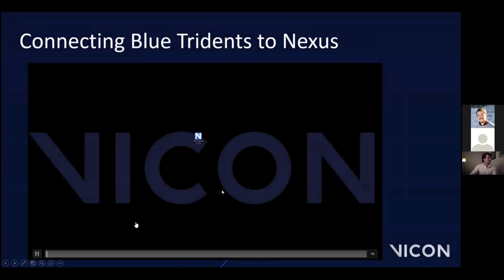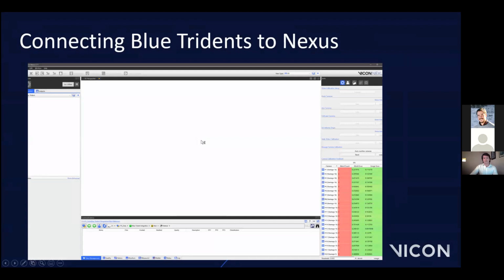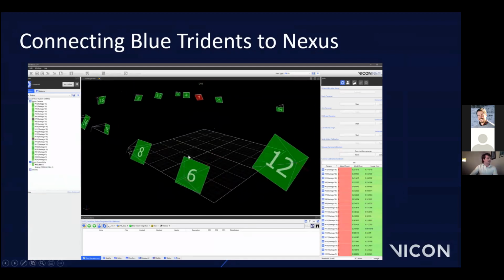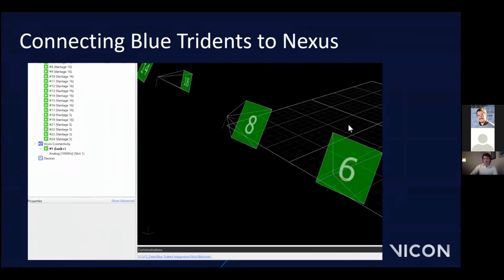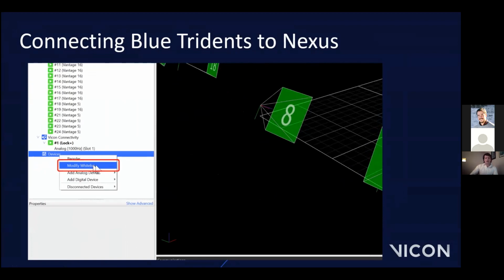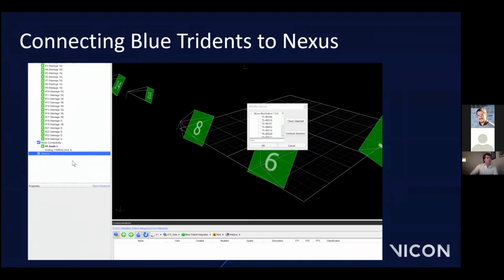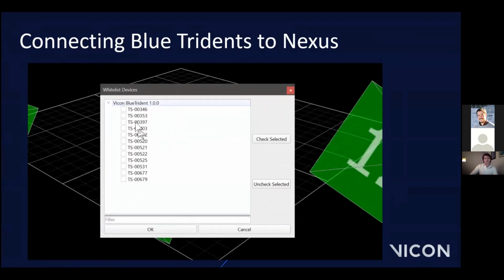Great, so let's just start that video again. So again, we just open up Nexus and just allow your cameras to connect as you usually would. I think we got to the dialog window before. Let's stop there. Great. So in the dialog window that pops up here, you can see all of your Blue Trident sensors listed that you should expect to see. And then you can go ahead and just select the sensors that you require.